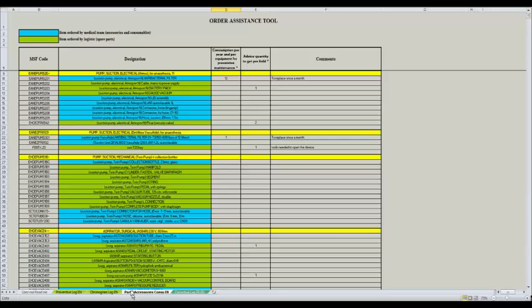Parts, accessories, consumables, EN. This table lists all spare parts and consumables related to the medical equipment. On the top left side, there is an information box which explains the meaning of the colors.